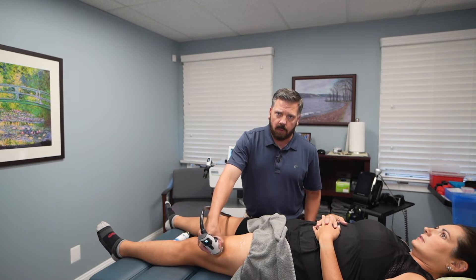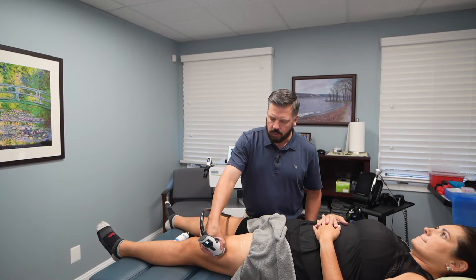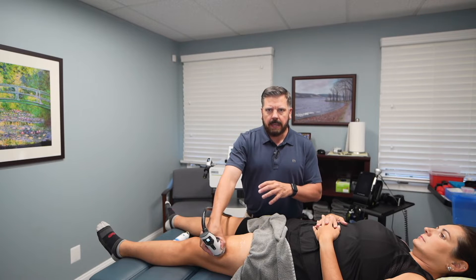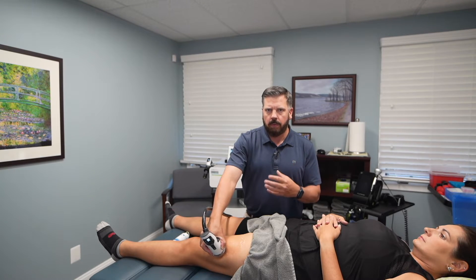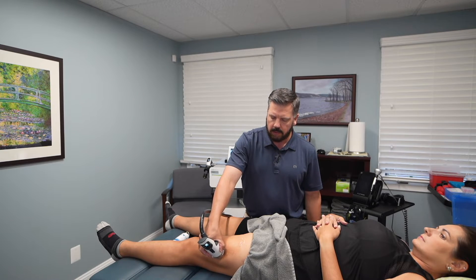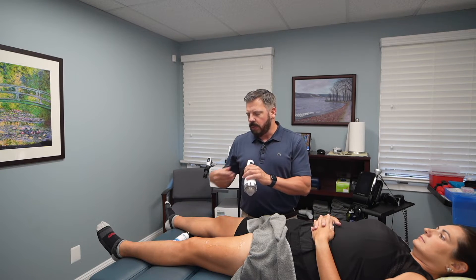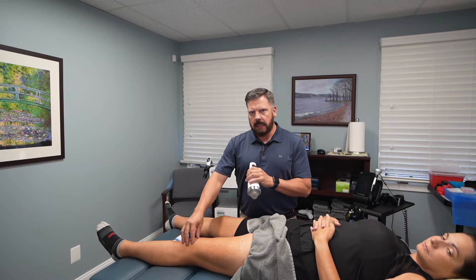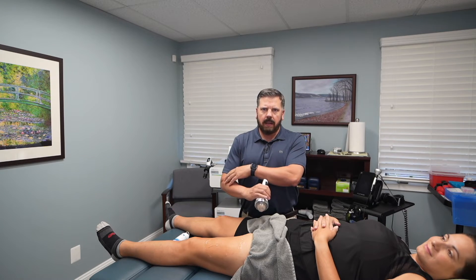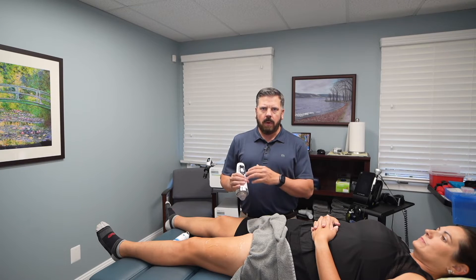I'm holding in one spot because it's very targeted — once we find that tender spot, we treat it specifically, then check any other tender areas. This is also diagnostic in nature: over normal muscle you won't feel much, but over the problem spot you feel that pinpoint location causing the issue. We often use focus shockwave on bony areas such as the knee, patellar tendon, Achilles tendon, plantar fasciitis, elbow tendonitis, and shoulder pain — areas where we can't typically apply the radial.